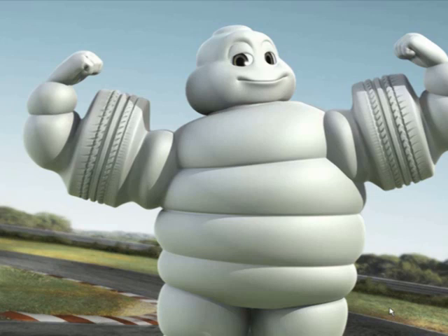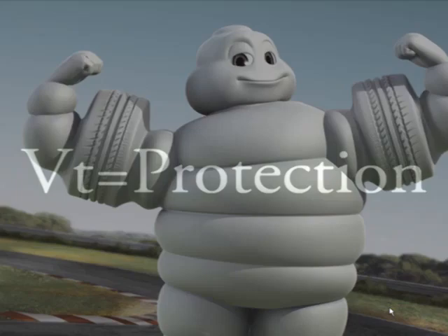I'm going to give you that computation in the handout that goes with this lecture, but usually I don't even bother. Just look at the patient. Based on their height, you say to yourself what an estimate of what their kilogram weight should be. So if the guy's 5'7", you say, oh, that's a 70 kilo guy. If it's a 5'1" woman, you say, oh, maybe a 50 kilos. And if you're off, it doesn't matter. It's fine. You're not going to be really changing the amount of tidal volume you give so much. The key is that if you see someone who's 600 pounds and 5'1", you don't give them the 600-pound tidal volume. You just say, oh, they're probably around 60 kilos. So you have now your settings, 8 cc's per kg based on some estimate of their ideal body weight.